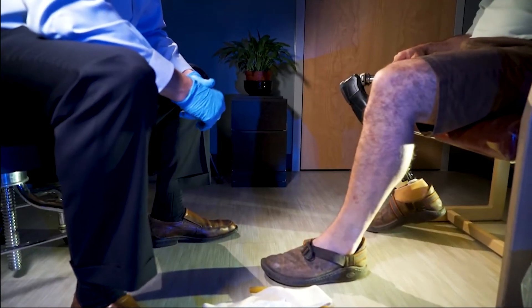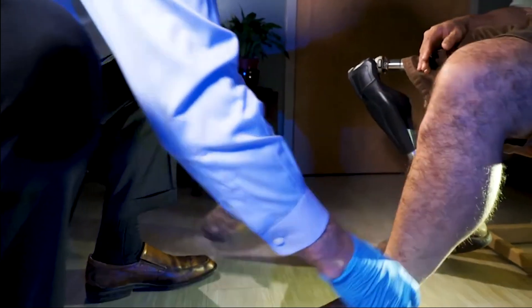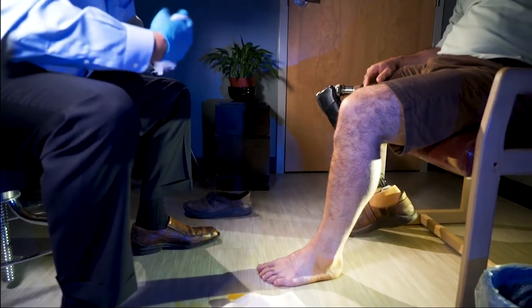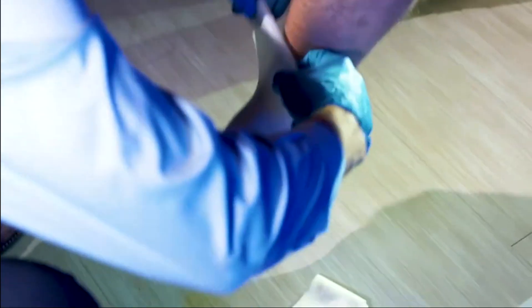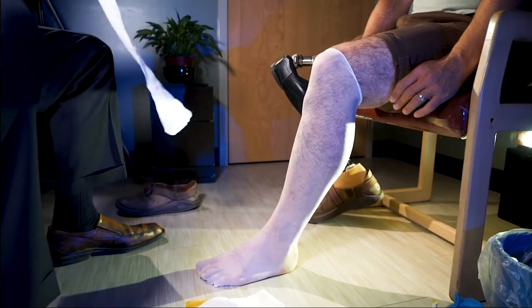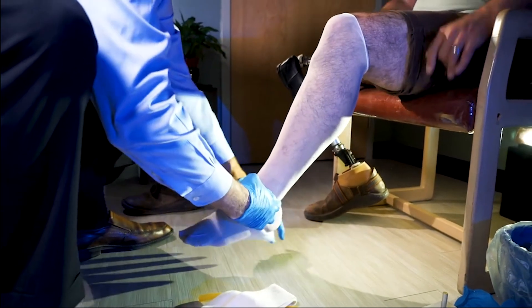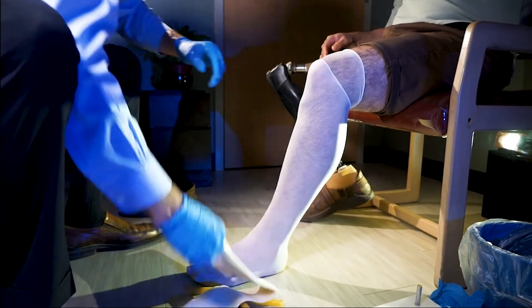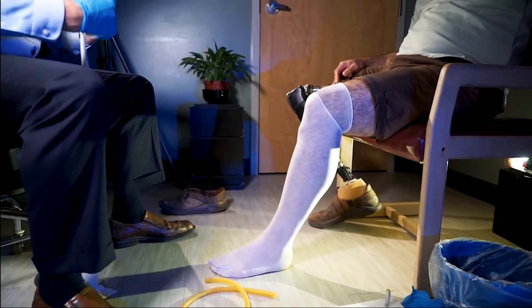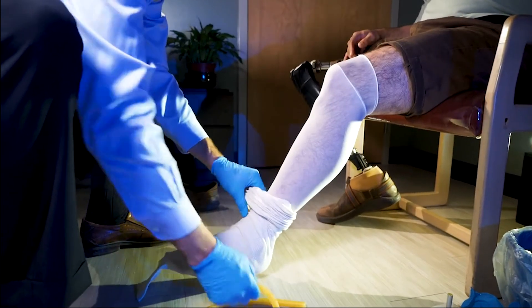We've already determined the proper heel height, which for this patient will be three-eighths of an inch. The first step in the casting process is to remove the shoe. We're going to apply two casting nylons, running them up above the knee. The third layer will be a cotton stockinette, and then we apply our cutting strip.